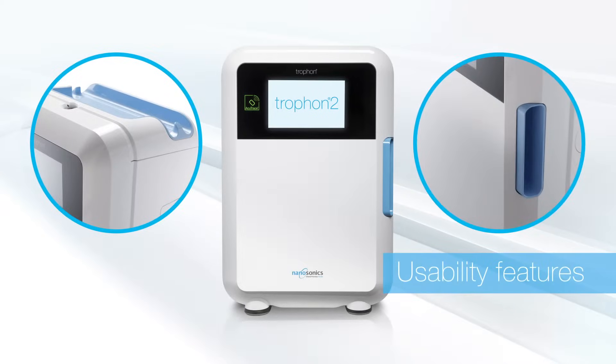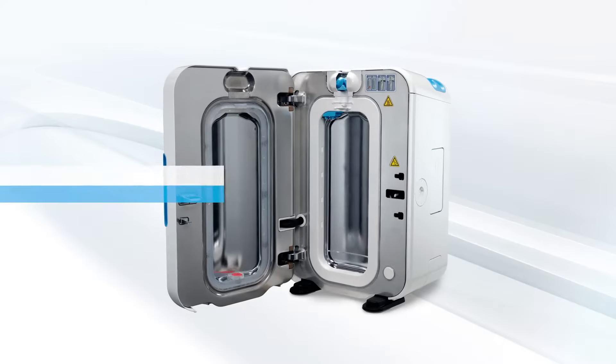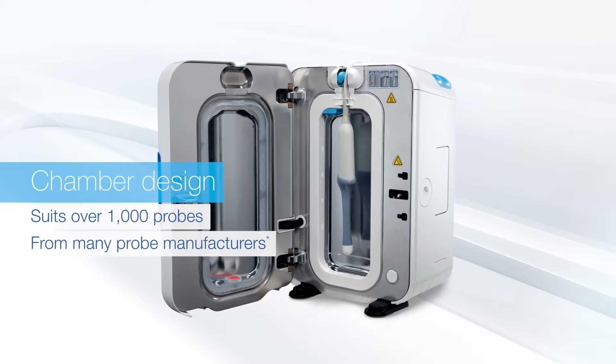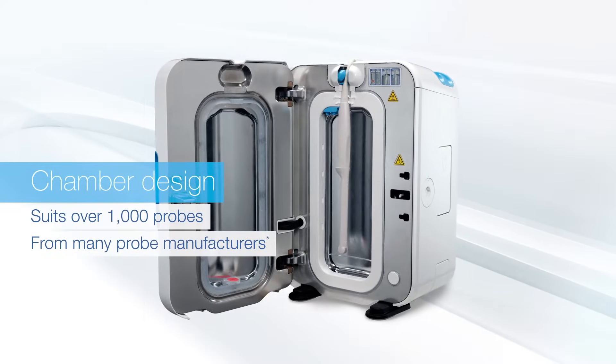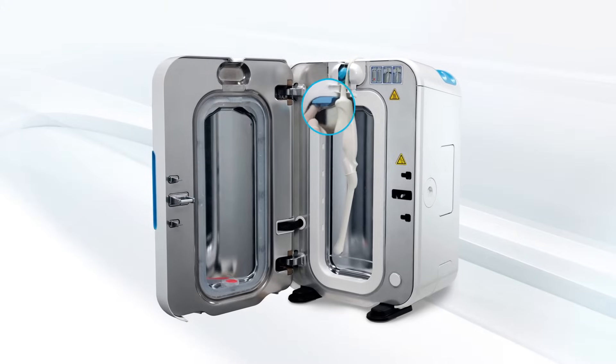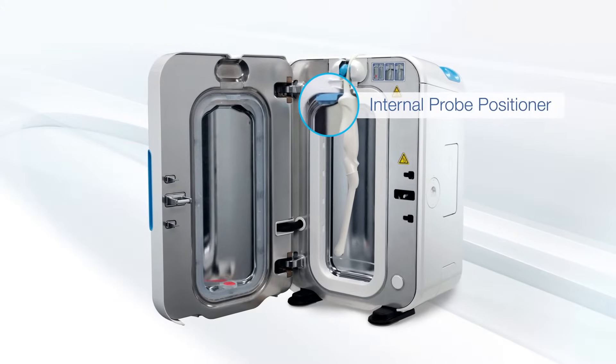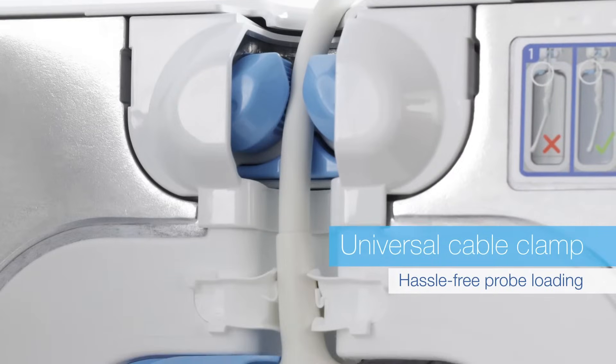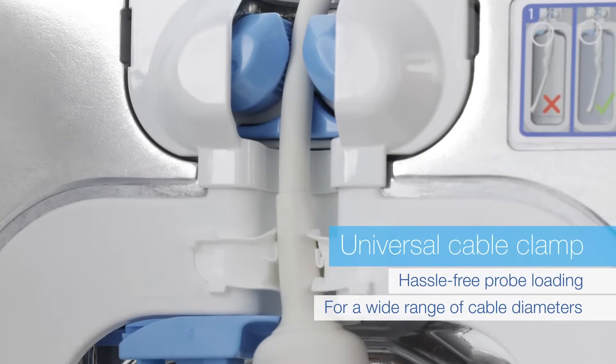With little touches that improve usability and a chamber design that suits over 1,000 probes, so whatever probe you use, Trofon has you covered. A universal cable clamp provides hassle-free probe loading for a wide range of cable diameters.